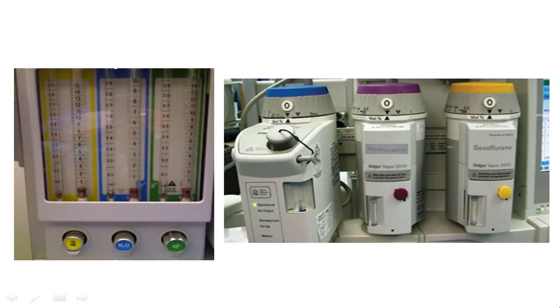So we all remember going back in the sim room and seeing what this looks like. And I would expect a test question. But there's going to be arrows pointing to the Thorpe tube at the liters per minute. I'm going to have certain arrows pointing. I'm going to ask you to calculate the FiO2. And then this dial will be set to a percentage. Expect 3 or 4 of those kind of questions on the exam.